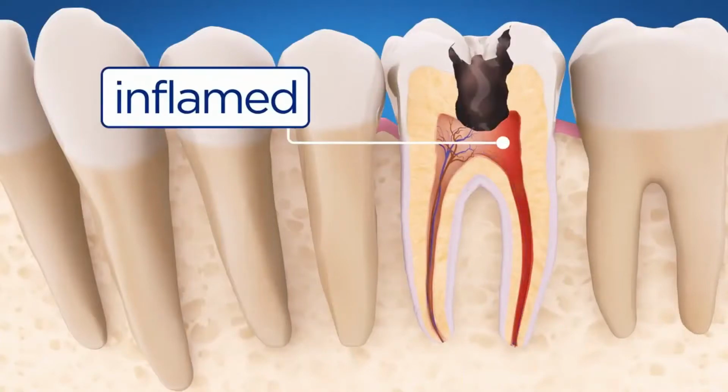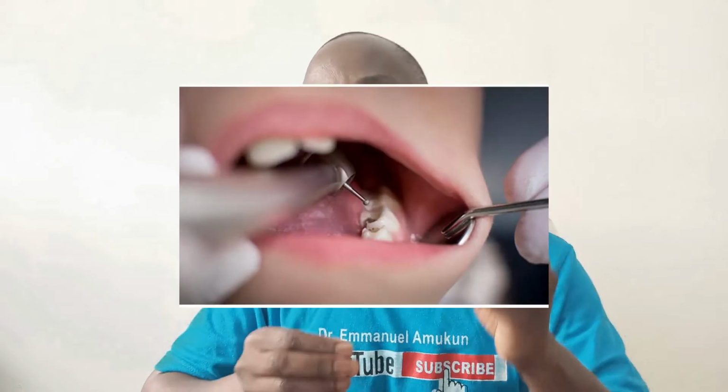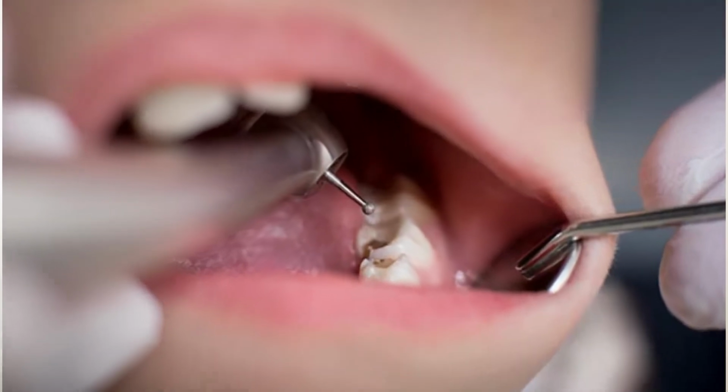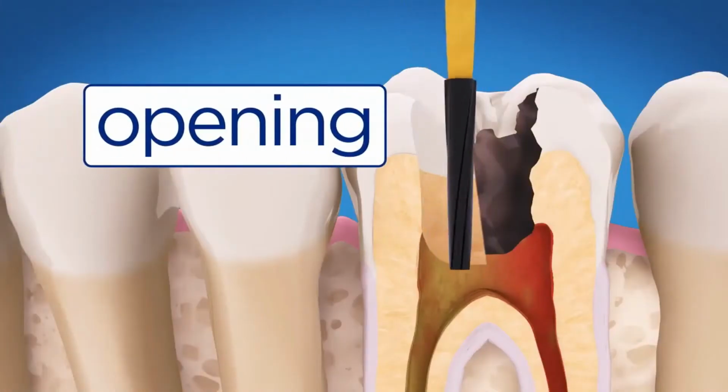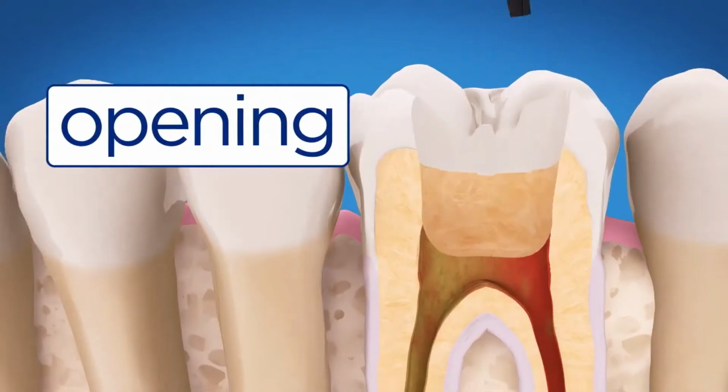Once we are done with that, then we go to the second step. The second step involves cleaning out the decay from the cavity. We do this basically by using a drill. We just pass it gently around the cavity to remove all the debris and all the areas that are decayed and make sure that it is clean.